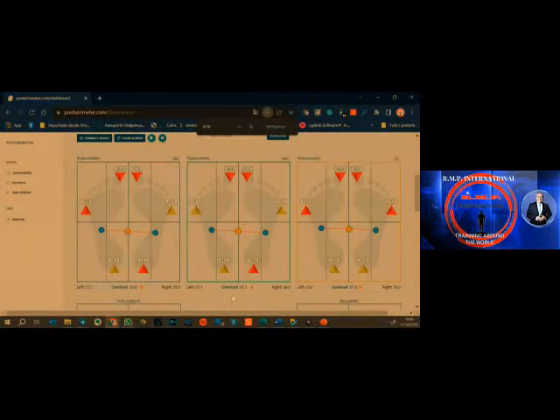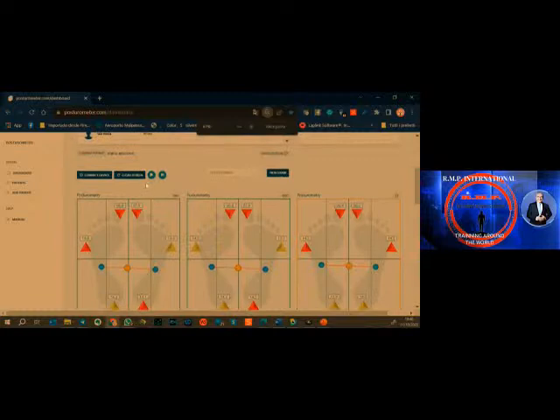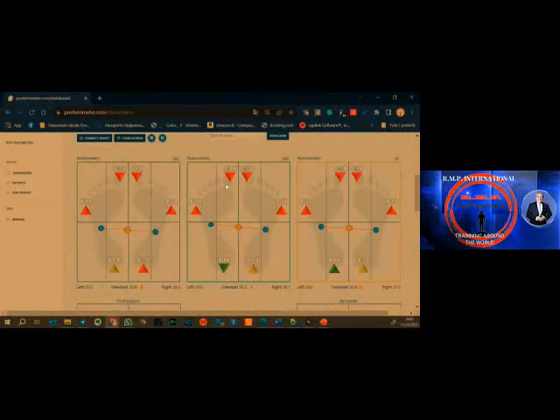You have here the 3 readings: mouth open, mouth closed, eyes closed. We see how it's affecting with the simple reading. You can review the exams. You play, and you see in real time the exams. You can see 1, you can see 2, etc.